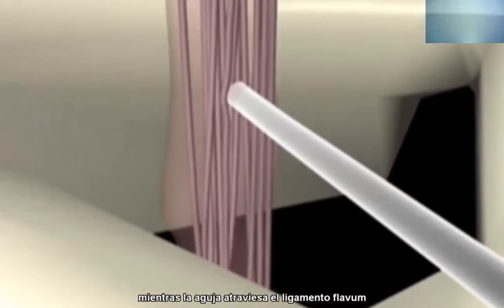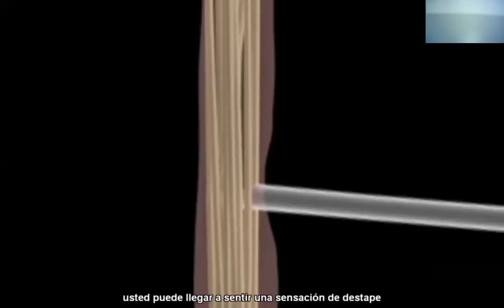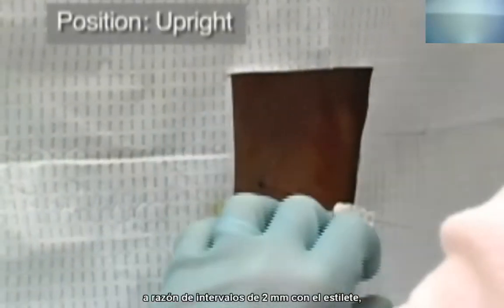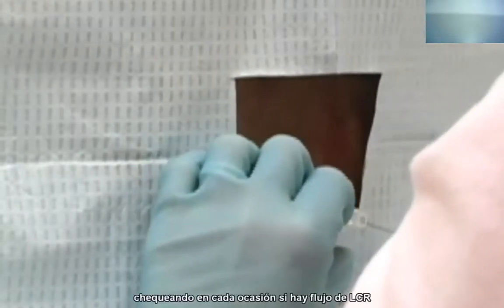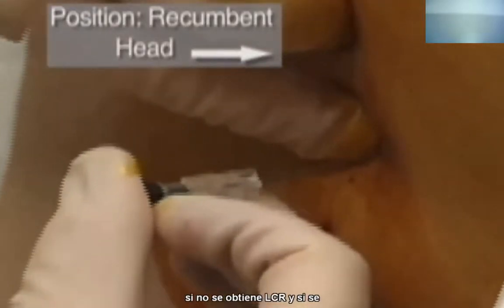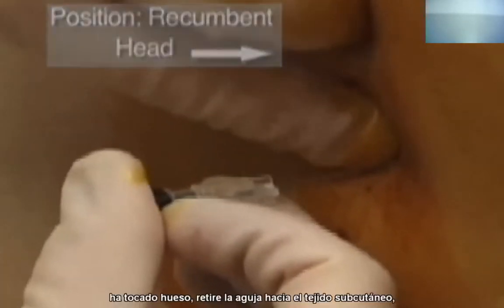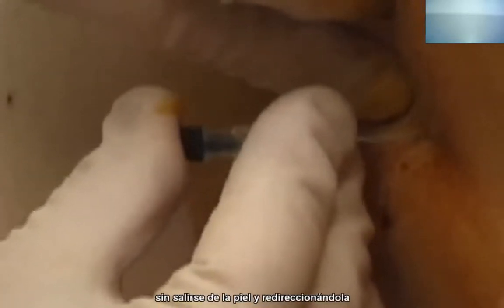As the needle passes through the ligamentum flavum, you may feel a popping sensation. Once you have reached this point, the needle should be advanced in 2-millimeter increments and the stylet withdrawn after each increment to check for CSF flow. If no fluid is detected and bone is encountered, withdraw the needle to the level of subcutaneous tissue without exiting the skin and redirect the needle.